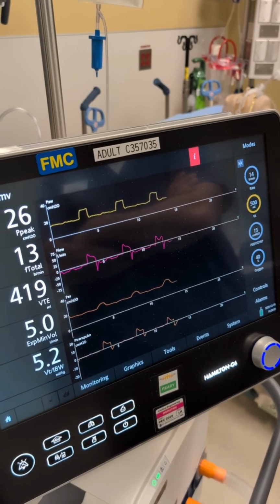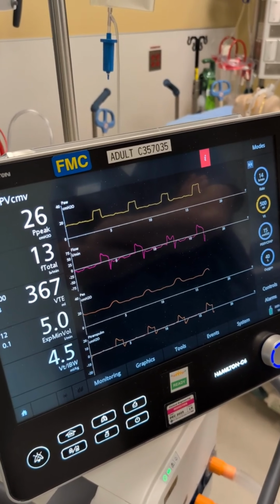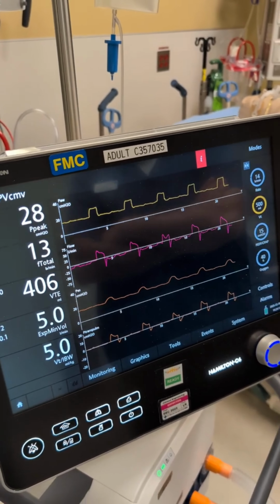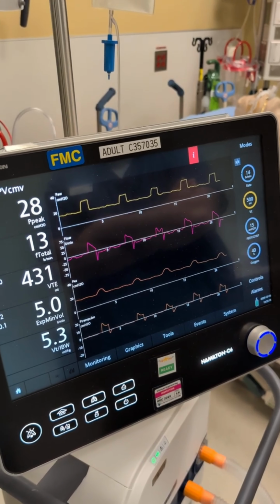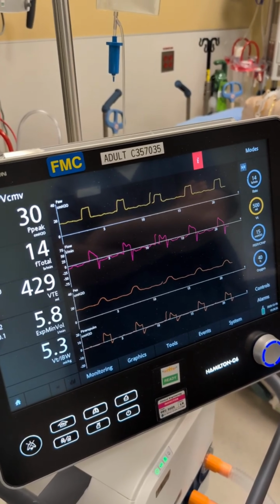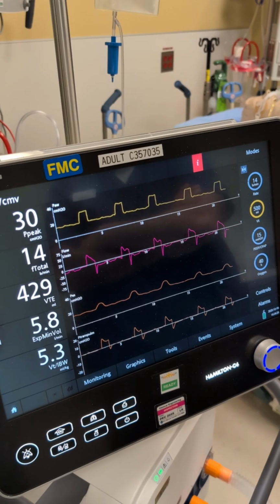In this example, since the transpulmonary plateau is 6, Pete increased the tidal volumes to provide more ventilation and then rechecked the transpulmonary plateau after the change. Overdistension of the lungs occurs at a transpulmonary plateau greater than 20.